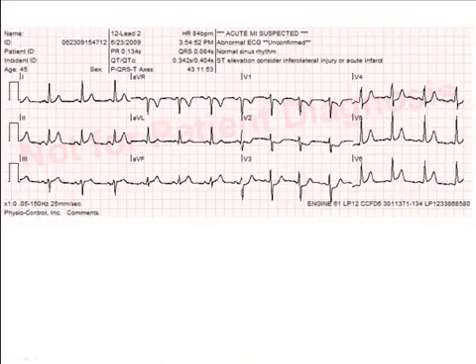Okay, let's get back to our strip interpretations. Keeping organization in mind, let's start with the confirmation of our diagnostic mode. Next, our calibration. Then, the heart rate. Is it too fast or is it too slow? If so, we would fix that now. Remember our goals of therapy. We'd be between oxygenation and pain management right now. But before we do pain management, we need to look at the QRS duration first.